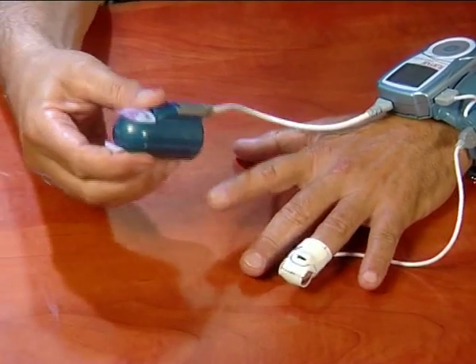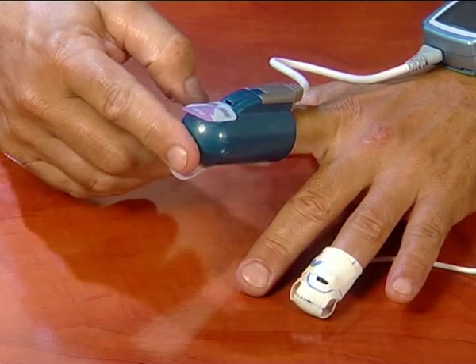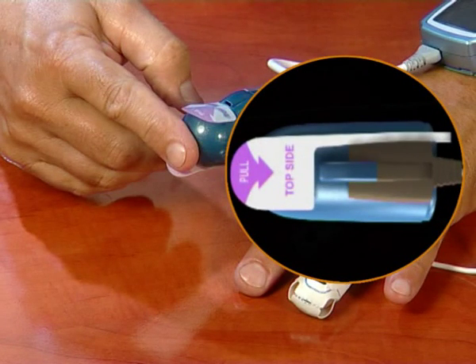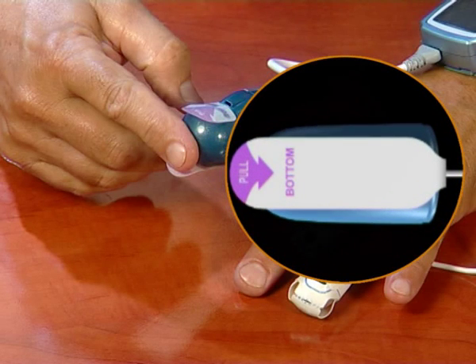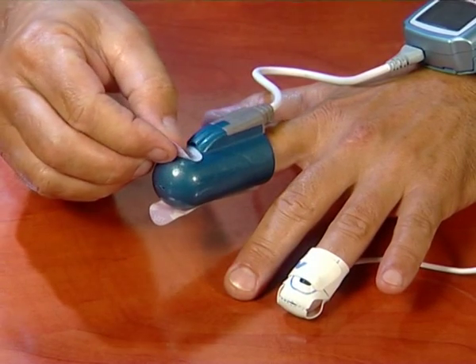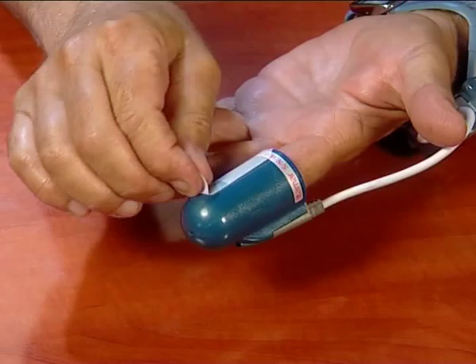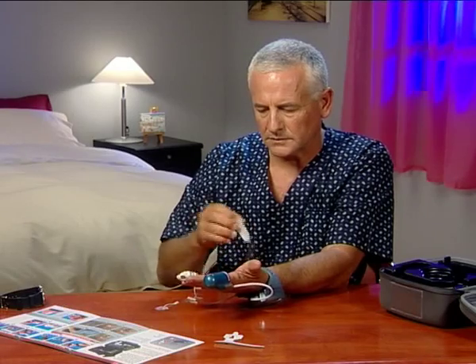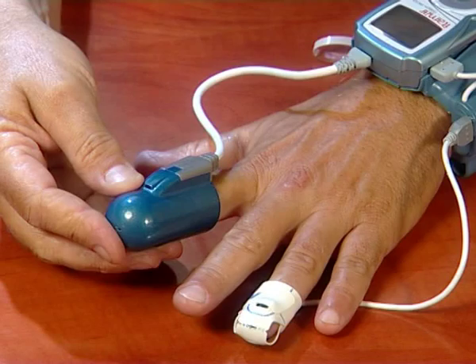Insert your index finger all the way into the probe. The tab labeled 'top' should be situated on the top side of your finger, and the tab labeled 'bottom' should be on the underside. Gently and firmly remove both paper tabs. Be careful not to twist the probe.